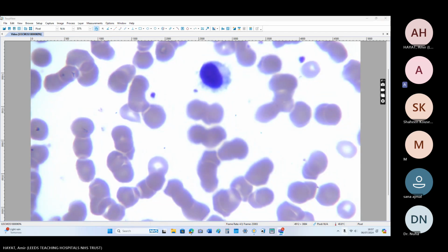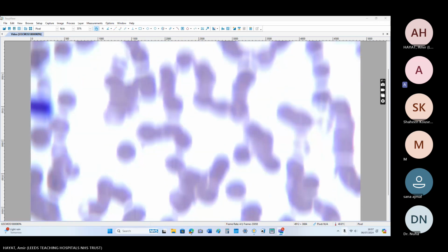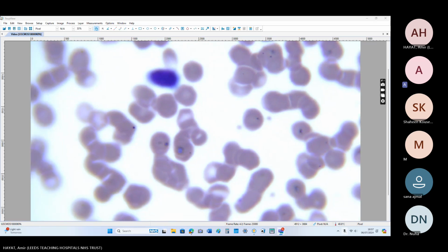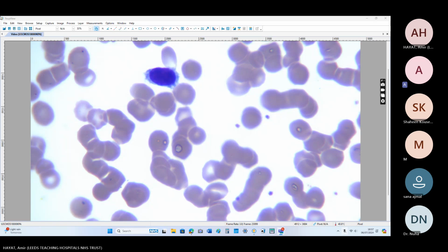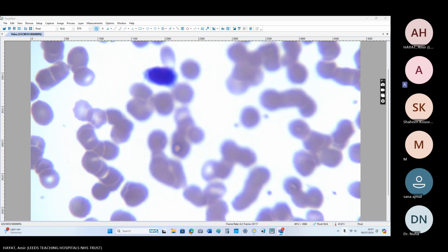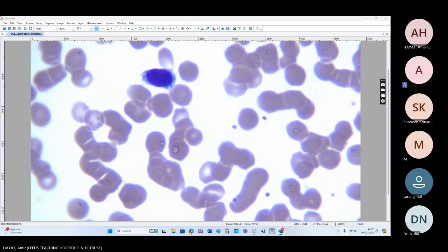Basically, it shows prominent lymphocytosis, with small to medium sized lymphocytes with abundant basophilic cytoplasm showing circumferential cytoplasmic projections, agranular. The nuclear chromatin is slightly clumped, and no nucleolus is seen. A few cells have a kidney-shaped nucleus.